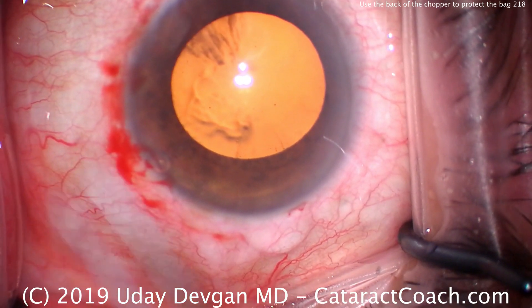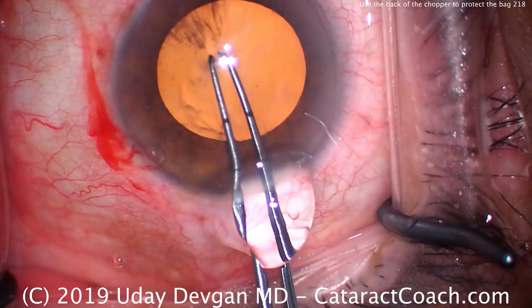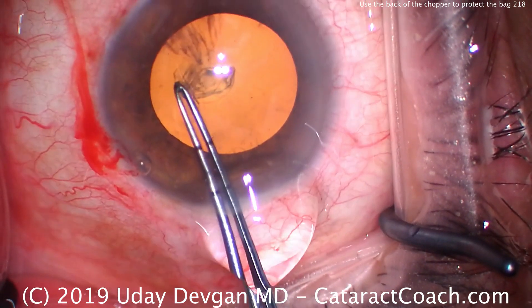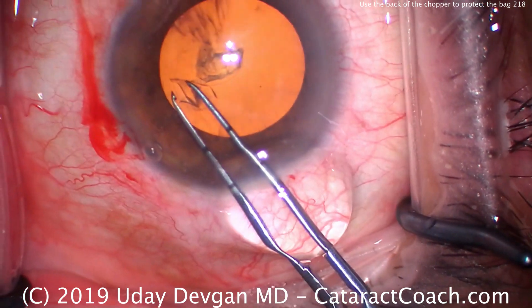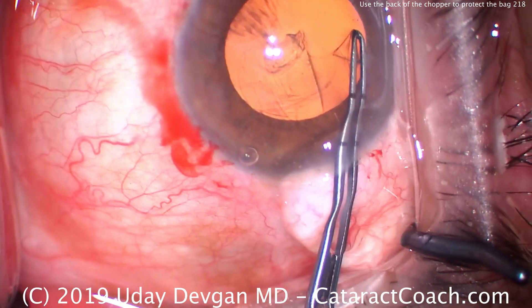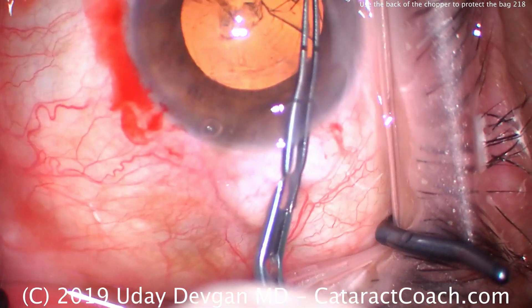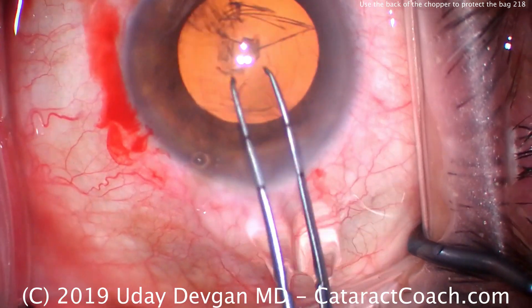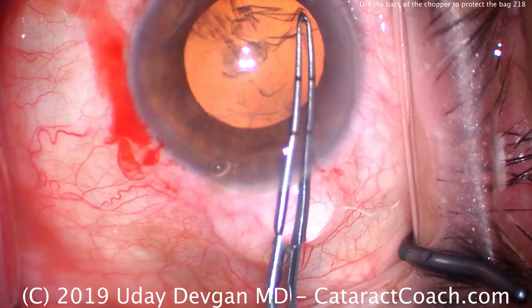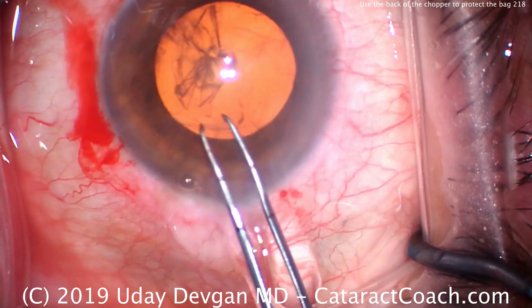We'll make our capsulorexis. In an eye that is smaller like this, we want to measure the capsulorexis. In this case we're going to make it basically as big as the dilation — right up against that pupil margin. While that may seem like an overly large capsulorexis, in fact it's the right size; it's about five millimeters in diameter. This pupil dilation is only about five millimeters. So we complete our capsulorexis here.